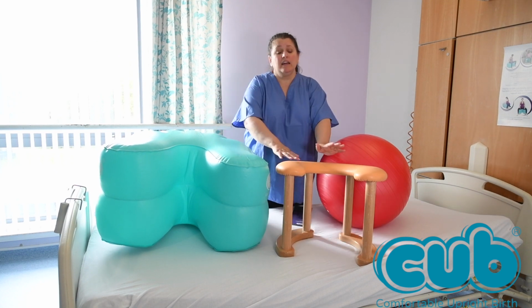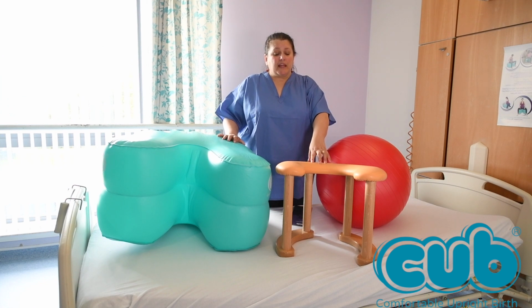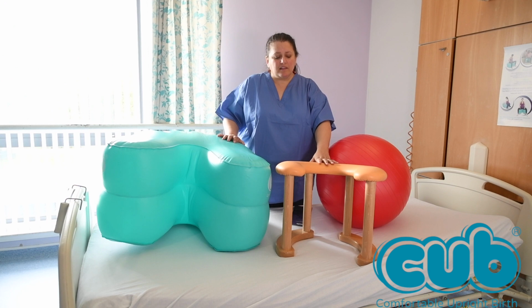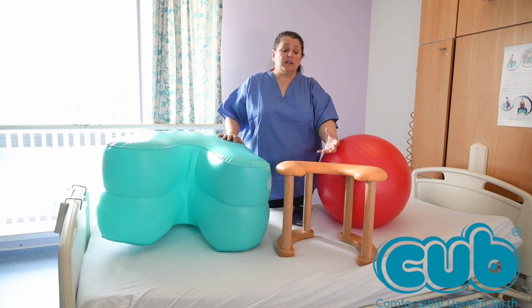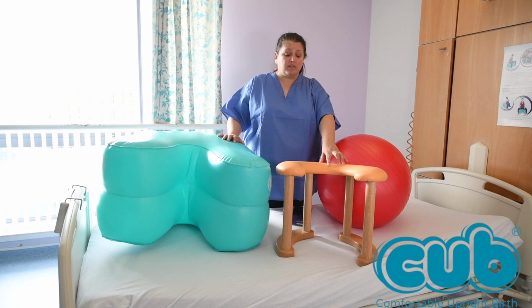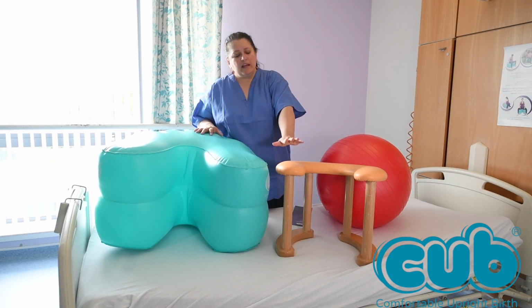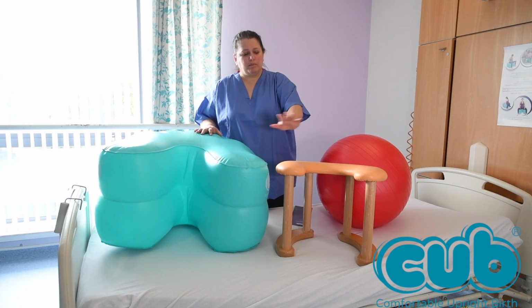So ideally, a birth stool is something that really should be used in the second stage of labour to help bring the baby down. Some women find them really uncomfortable to be on for any length of time. Some providers aren't that keen on them, but other people are. Again, it's a tool that might work for some but not work for others. So it has its advantages and disadvantages, but what are they compared to the CUB?